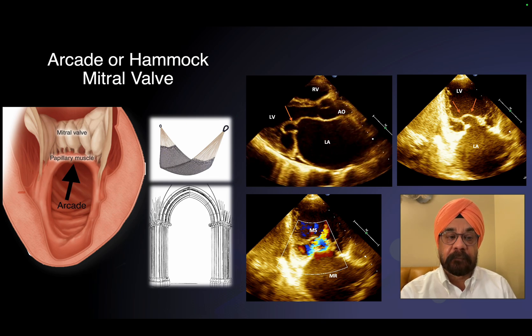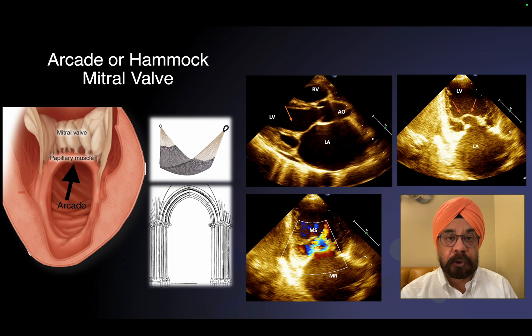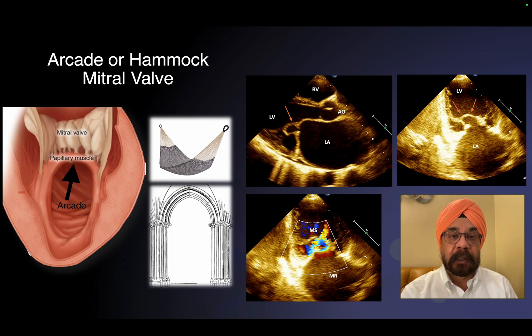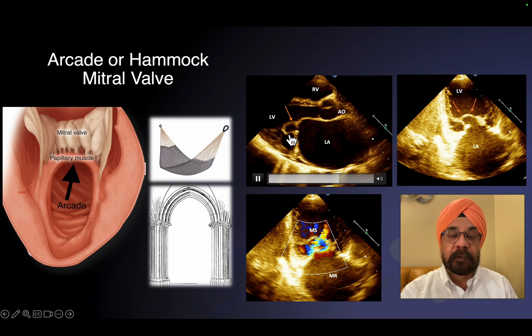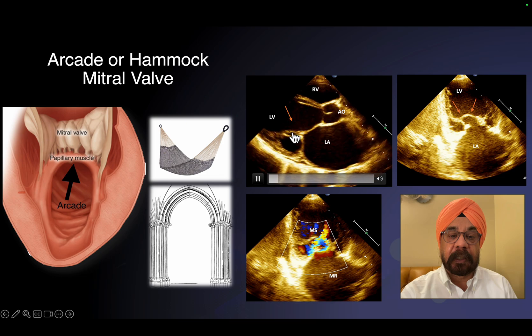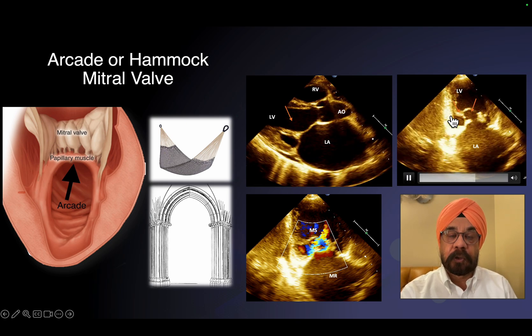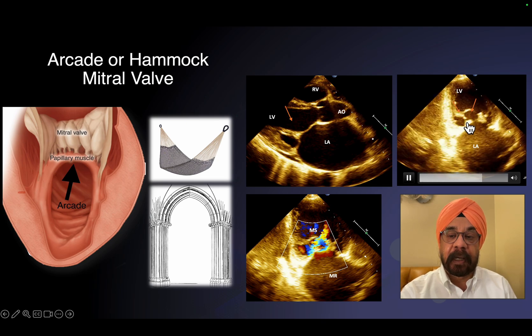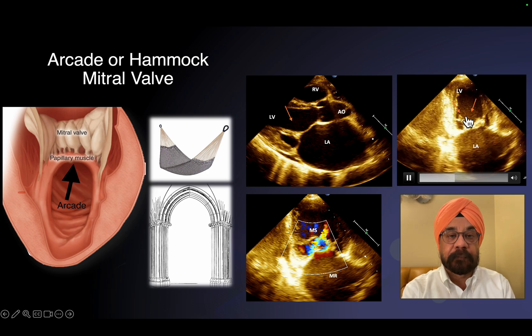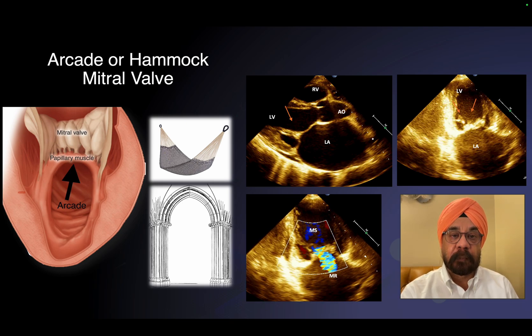What is a hammock and arcade mitral valve? Basically, there is a fusion of the papillary muscles, fusion of the chordae — chordae can be short, chordae can be irregular — and the chordae and subvalvular apparatus can insert proximally rather than going towards the apex. Look at this case: this is the mitral valve making an arcade or hammock. This is a short papillary muscle, the chordae are fused with each other. On a four-chamber view, you see a short, grossly abnormal papillary muscle attached quite proximally rather than at the mid and apical part of the LV, and you see this doming of chordae fused with each other. It's called a hammock valve and it produces mitral stenosis and mitral regurgitation.